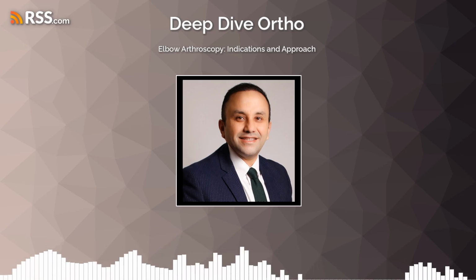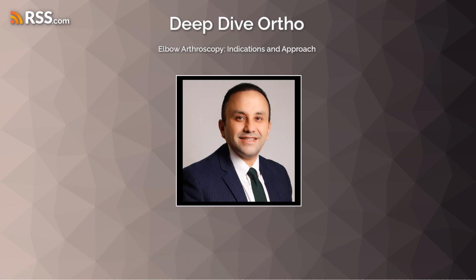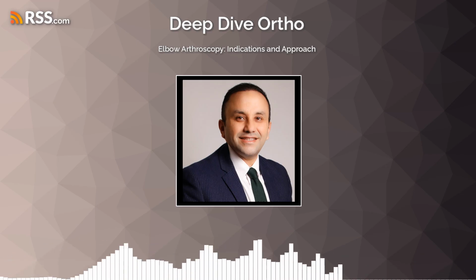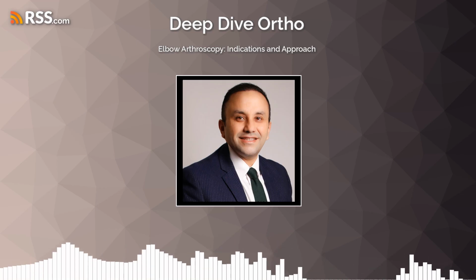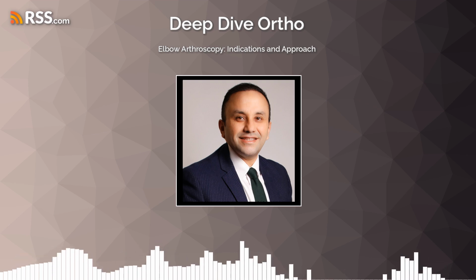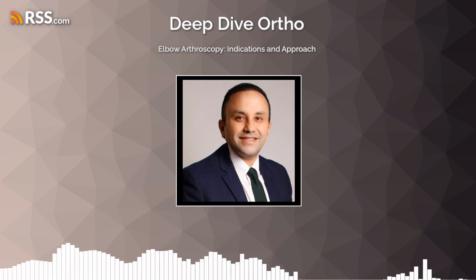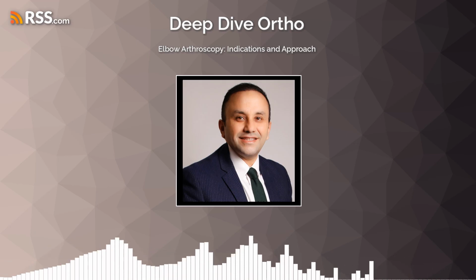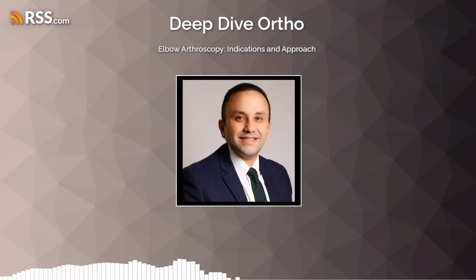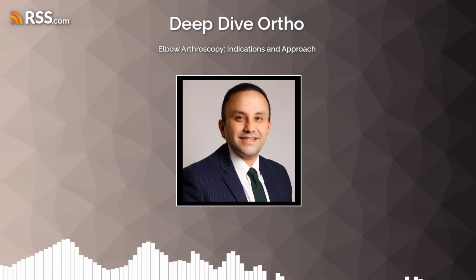For coronoid fractures, surgical intervention is recommended for Regan and Mori type 3 fractures, which involve a significant portion of the coronoid, or any fracture interfering with joint motion, as these are crucial for restoring anterior and medial elbow stability. While isolated coronoid fractures traditionally required aggressive open approaches, arthroscopic techniques are increasingly effective. The arthroscope is placed in the proximal anterolateral portal to view the medial elbow.